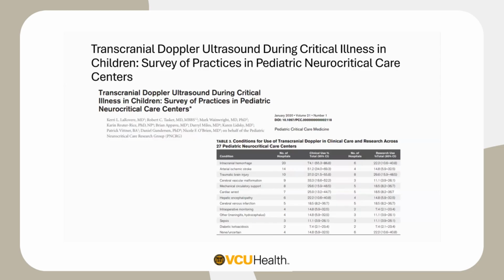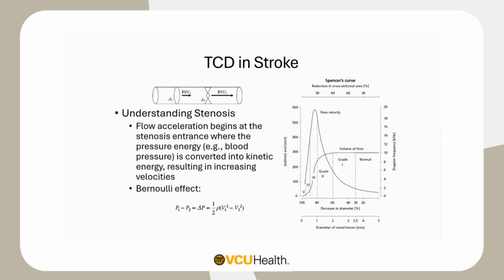Now, this study didn't really go into specifics regarding how it was being used for ECMO. Across the board, though, there were descriptions that TCDs may be used for manipulation of vasoactive agents to target cerebral perfusion, or for discussion regarding neurosurgical interventions, or the necessity of neuroimaging. I know Marina alluded to some of this in her last talk.